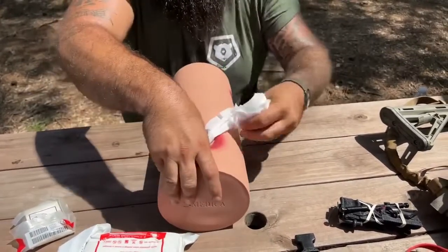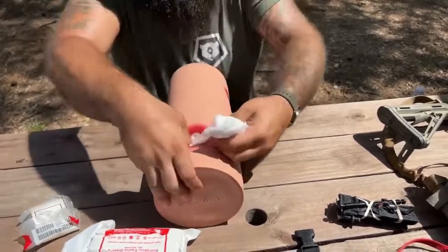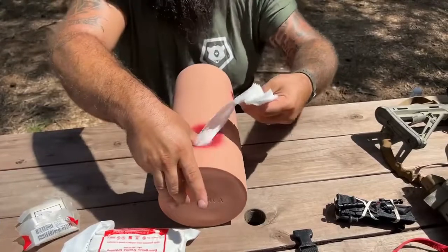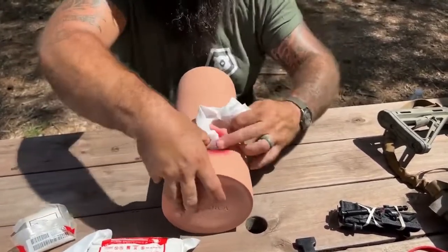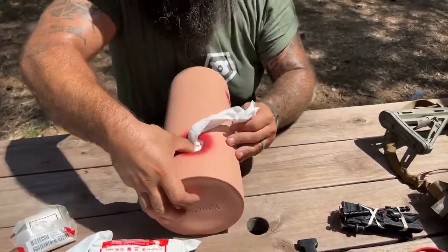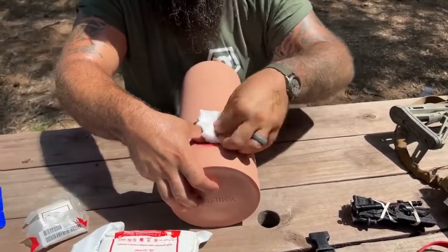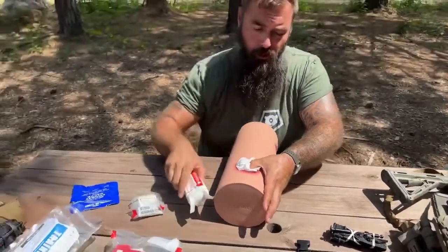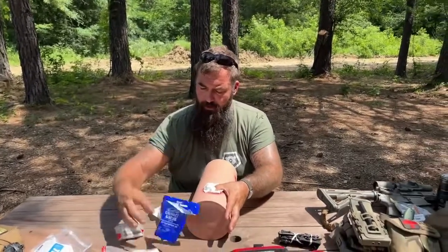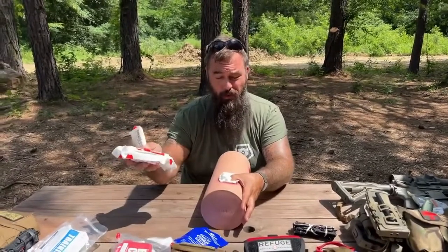Because it's not a one-dimensional wound — it's not a straight linear line. Keep pushing until that wound is entirely full and you've got gauze sticking out the top so you can't get any more in. Constantly applying pressure throughout. If you have leftover gauze, bunch it up over the top and hold pressure. Now I need my pressure bandage to hold this gauze in place. Pressure bandages and hemostatics or compressed gauze go hand in hand — these two are like love and marriage, you can't have one without the other.